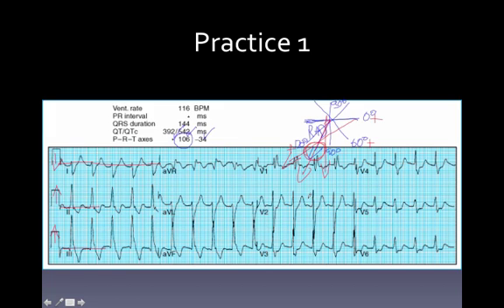So print off those cards, or have your instructor print off those cards that are on there, or use the cards that I've given you and double check the computer's work. It never hurts. So we have a down, up, up, 106. The machine, in my opinion, is on the money.